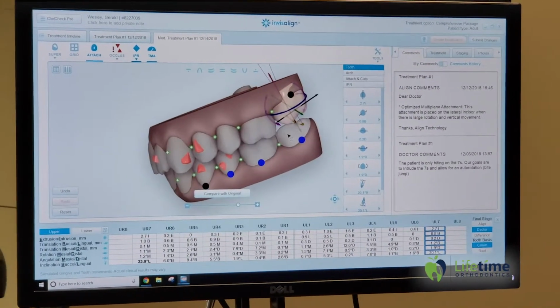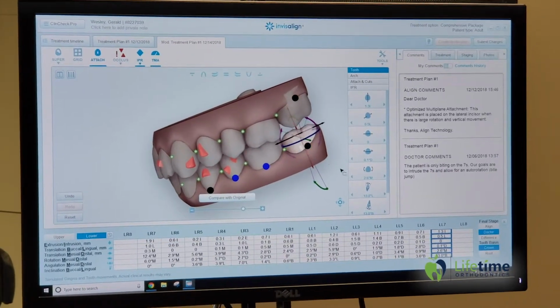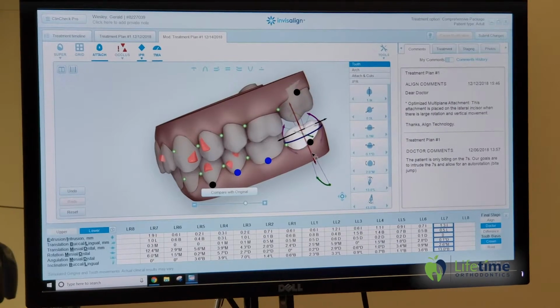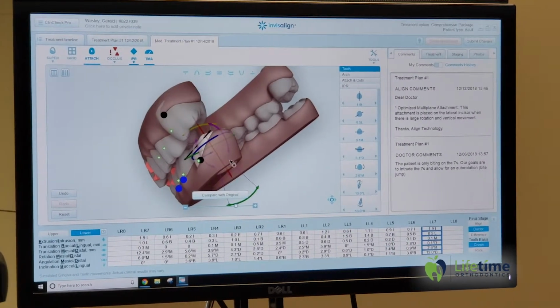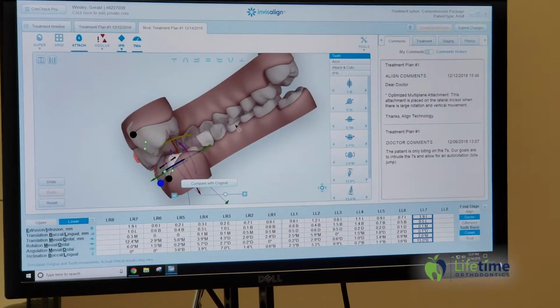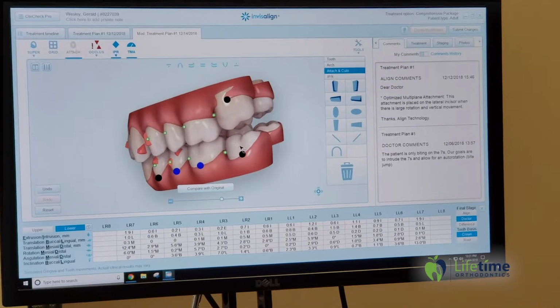And then I'm going to do the same on the bottom here. I'm going to move this down a few millimeters. Let's see, that's about 1.3. We'll intrude that about 2 millimeters. And again, just because I put this movement on the tooth doesn't mean it's going to happen. So I'm going to put a little attachment on that tooth just to kind of help to correct that.